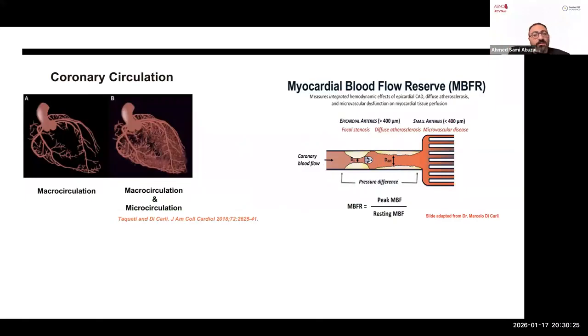But I think they're really more robust, and practically and clinically available, with cardiac PET, because we can detect blood flow not just in a single area but see it in the entire blood stream, to differentiate whether it is focal stenosis, diffuse atherosclerosis, or microvascular disease. And knowing the myocardial blood flow and the other metrics in the cardiac PET will help us with that.